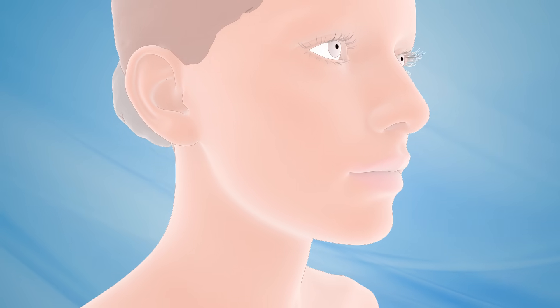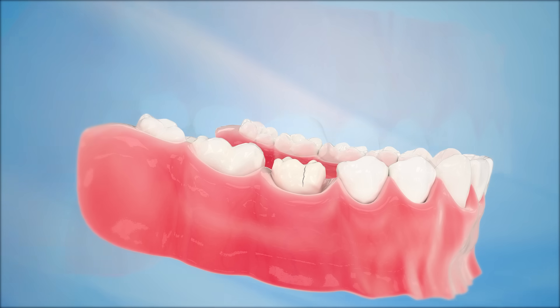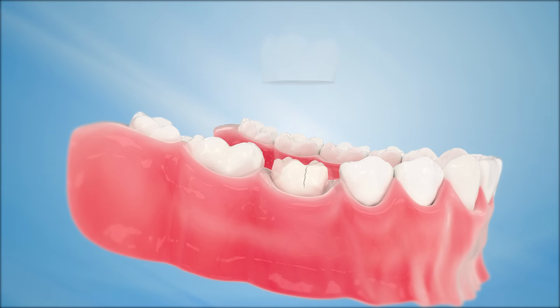A dental crown is a tooth-shaped cap or cover placed over a remaining natural tooth structure. Dental crowns restore a tooth's original shape, size, strength, and overall appearance.